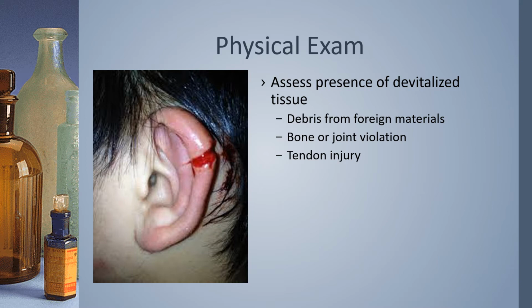Wounds that are less than 5 centimeters and not under tension are the ones that you can really close with that skin adhesive. Clean, uninfected lacerations on any part of the body in healthy patients may be closed for up to 18 hours following the injury without a significant increase in the risk of infection. Facial wounds, however, may be closed up to 24 hours after injury. Now, mind you, there are select cases where closure of facial wounds may be done up to 72 hours after injury. These are not ones I recommend that we as practitioners in clinic do. These should be done more along the lines in an emergency room with the use of a skilled surgeon.